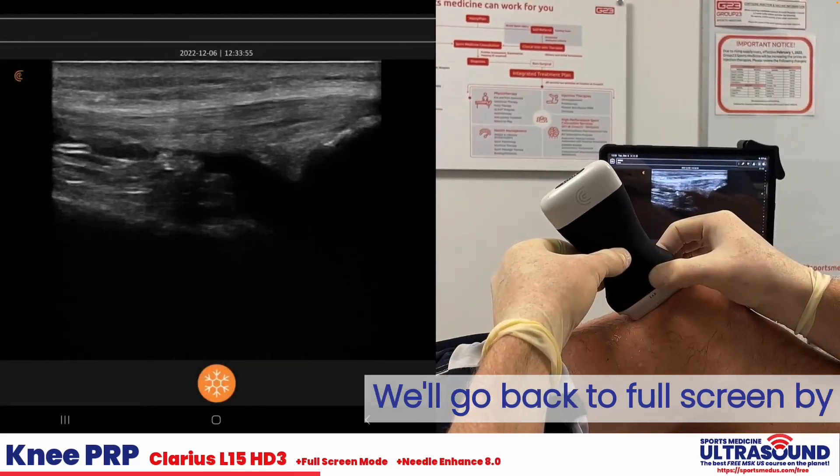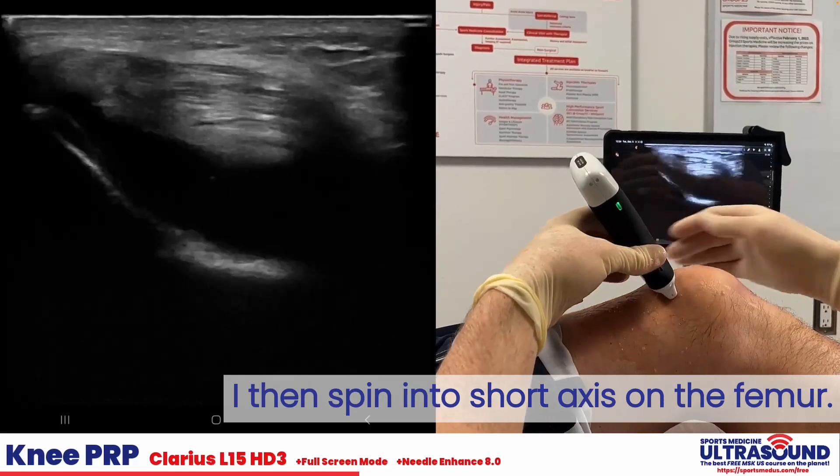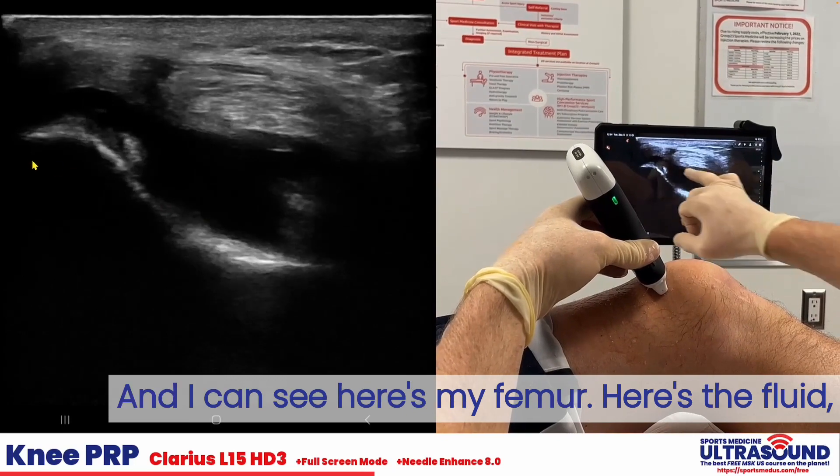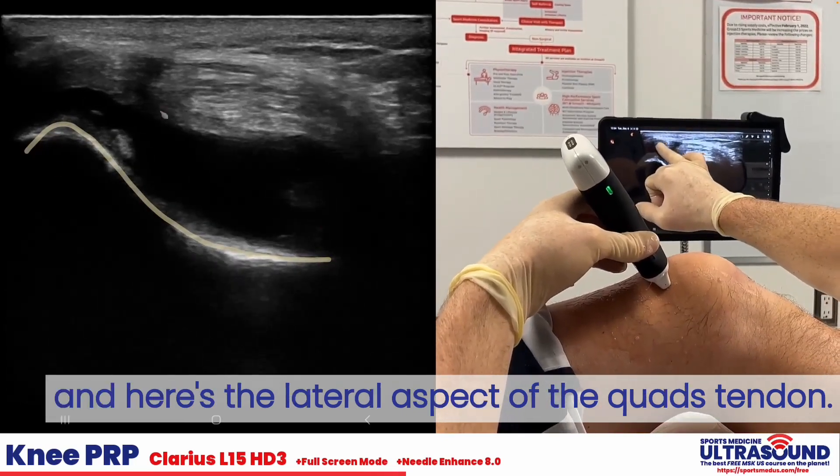We'll go back to full screen by double-clicking the top button — that's how I set up my preferences. I then spin into short axis on the femur, and I can see here's my femur, there's the fluid, and here's the lateral aspect of the quad tendon.